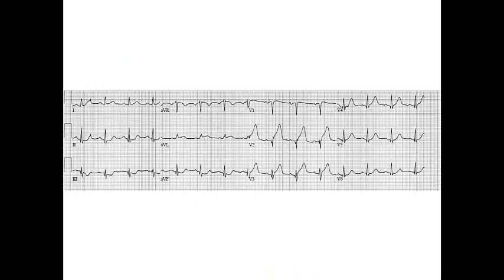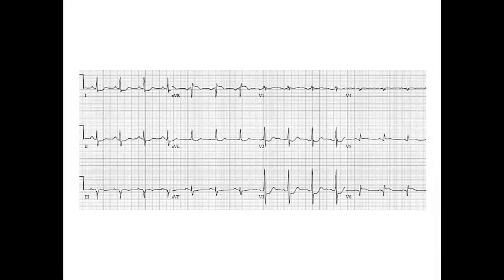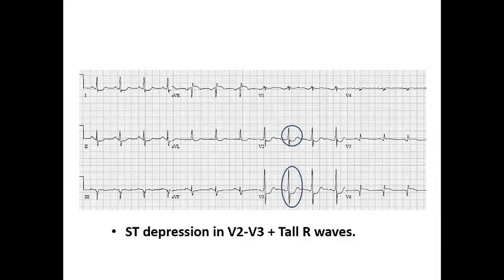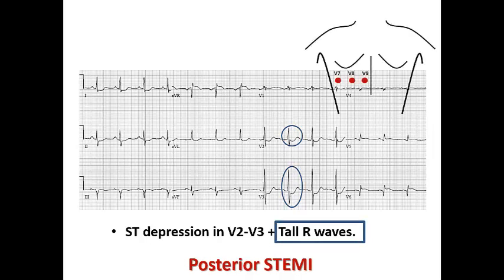In another example, we see ST depression in inferior leads with ST elevation in lateral leads, indicating high lateral STEMI. Here, ST depression in inferior leads accompanies ST elevation in V1 to V3, indicating anteroseptal STEMI. And in this ECG, ST depression in V2 and V3 with a tall R wave and hyperacute T wave — this reminds us of posterior STEMI. Placing posterior ECG leads (V7, V8, V9) for this patient would detect ST elevation, confirming posterior STEMI.